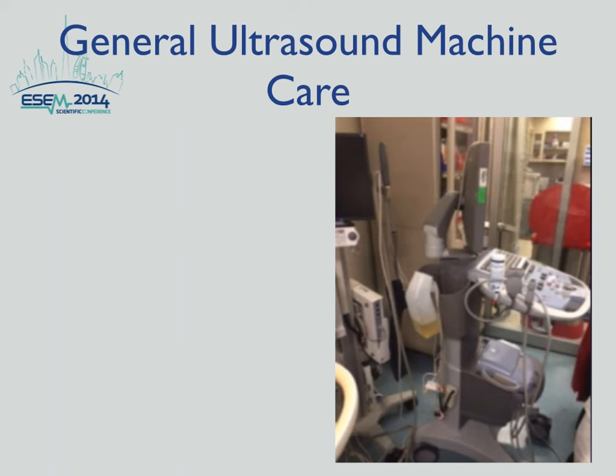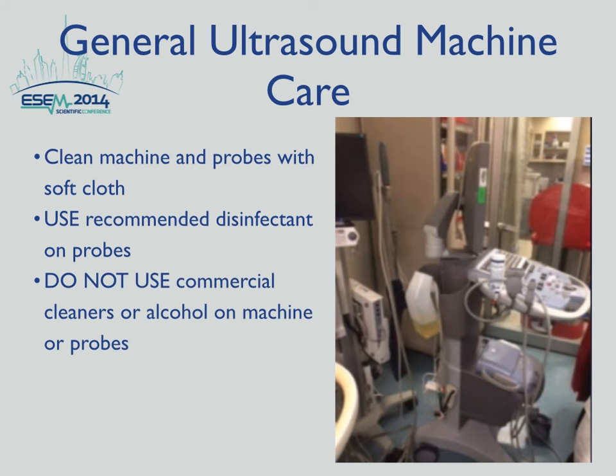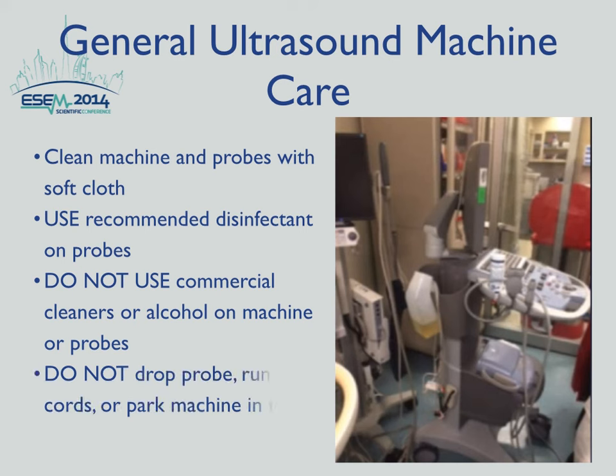So remember, these machines are expensive, so keep your machines clean, and you can clean the machine and the probe with a soft cloth. You can use the recommended disinfectant on the probes. Do not use any commercial cleaners or alcohol on the machine or the probes. And do not drop the probes, run over the cords, or park the machine in traffic, because that's just going to ruin the ultrasound machine and therefore it will be out of service and you will not have this valuable technology with you.